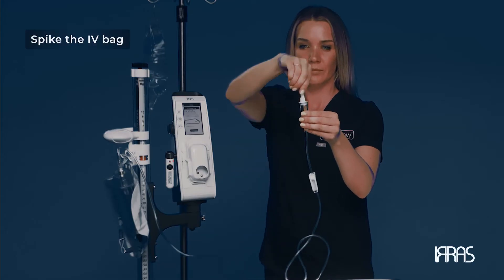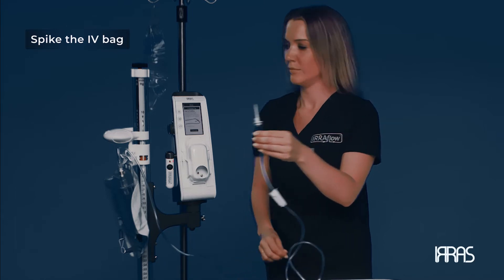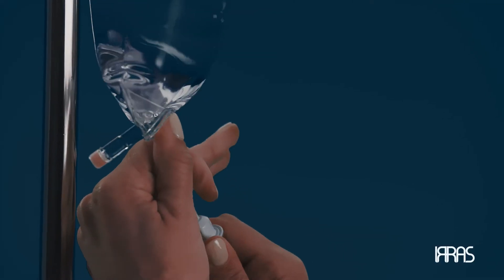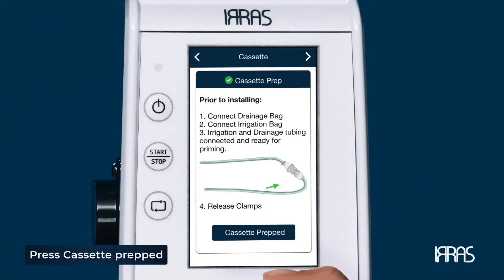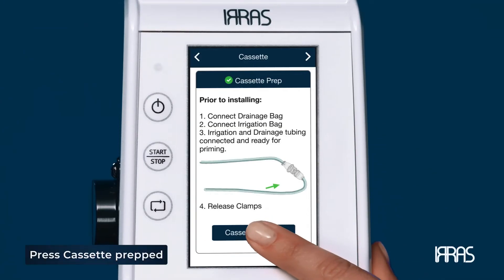Using the IV spike, remove the protective sterile cover and spike the irrigation bag, filling the drip chamber. Press cassette prepped on the screen to continue.